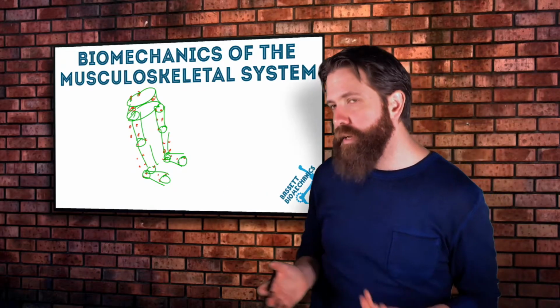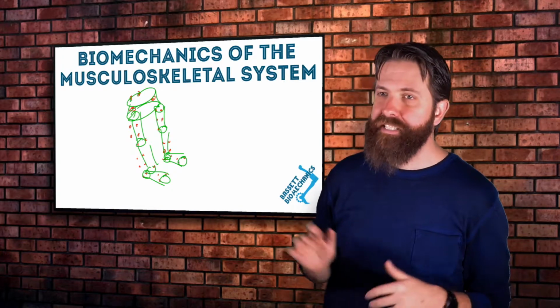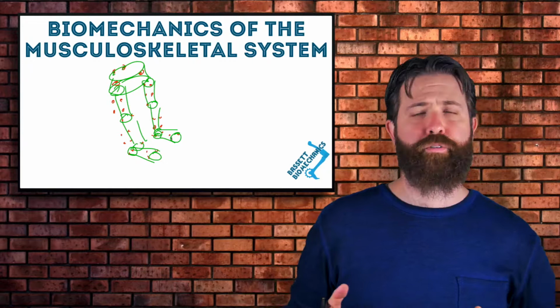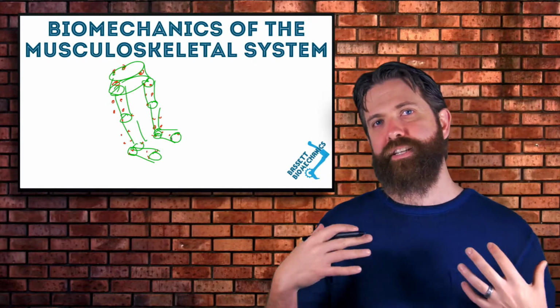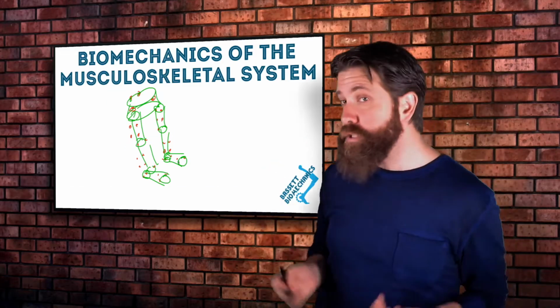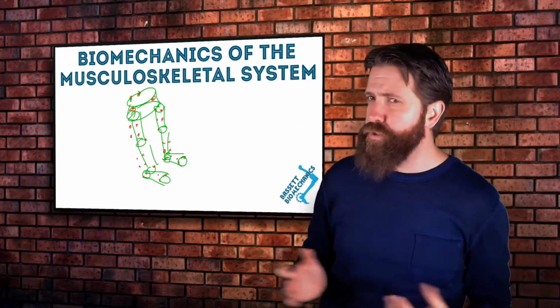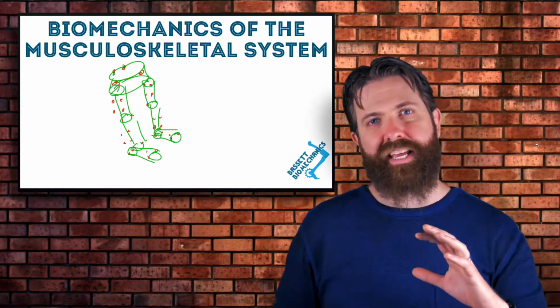For the most part, we end up working with a cluster type of marker set, or CAST, as these are based on Aurelio Cappozzo's work and have been extremely influential in the field of biomechanics. My personal preference is to use a cluster type of marker set, largely because its impact on reducing skin movement artifact is huge.